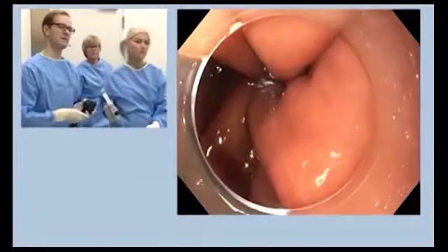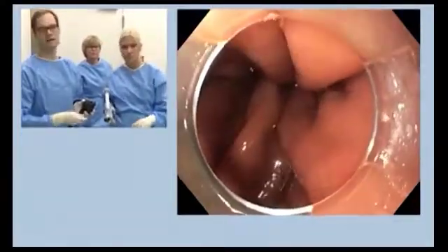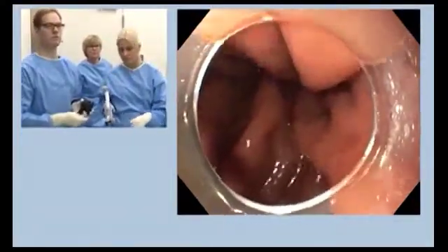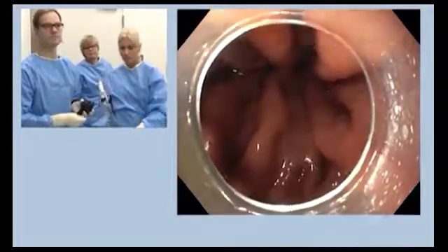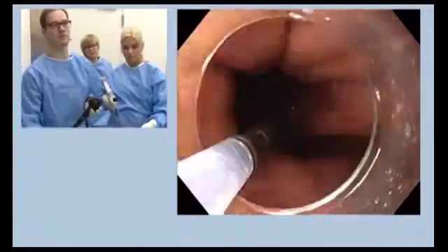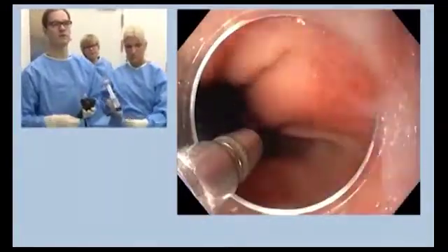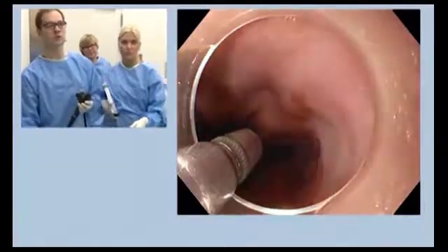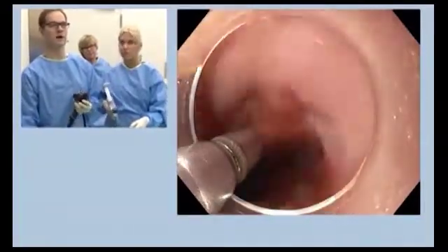Now we've got ACC loaded and we're cleaning the mucosa with it, so as to get the best contact area possible with as little mucus as possible on it. We also have a 4 mm distancing cap and we can now treat this area quite locally.